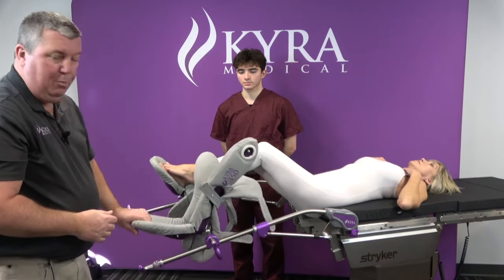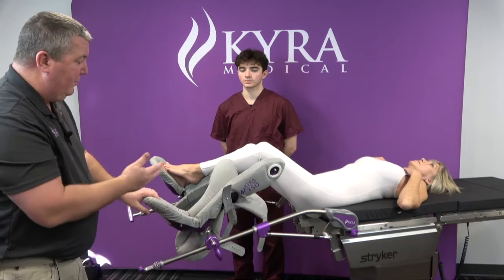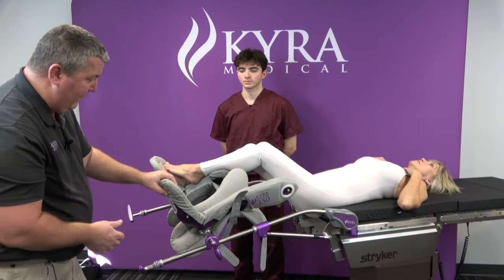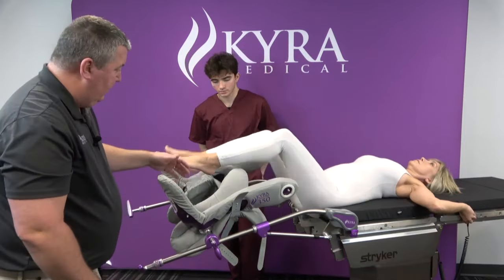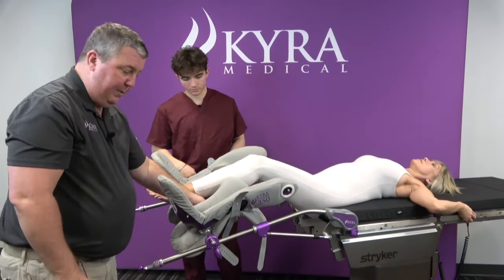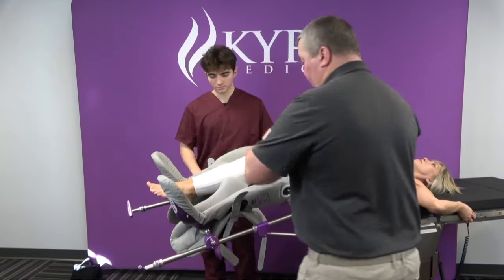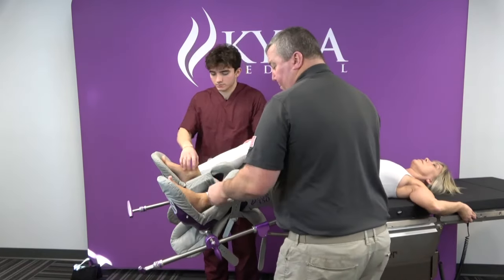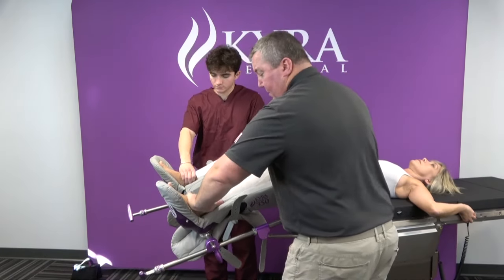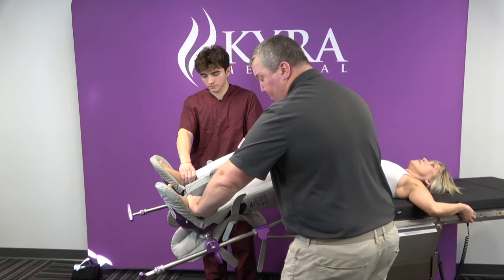At this point, the only thing that should be moving is the free flow to the boot, and that's a safety feature I've discussed in another video. Once this is all set up, the patient's legs are on the transfer board. We're going to do this in symmetry — pick up the patient's legs, move them in, and push that ankle to make sure it's fully seated into the boot.